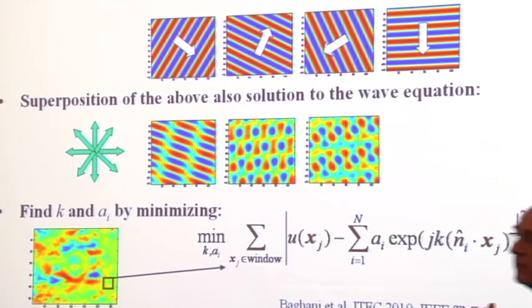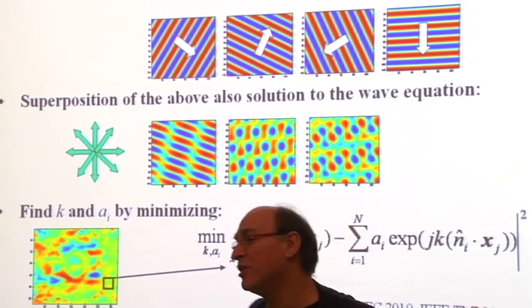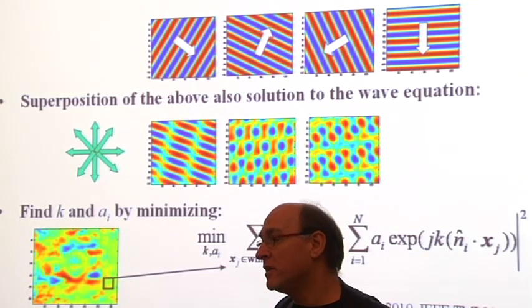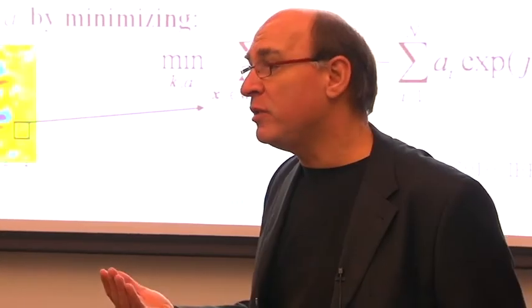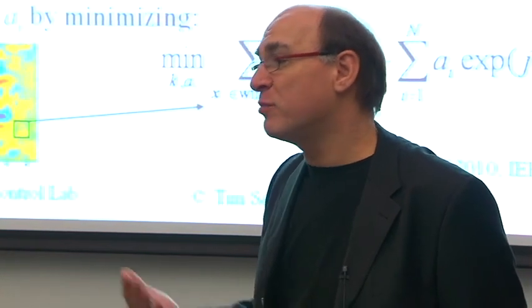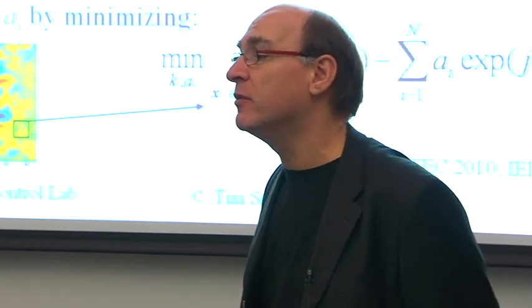In fact, the physics behind it is totally mind-blowing, to me at least, because what you have is using ultrasound to measure displacement. So how can that be? Ultrasound goes at 1540 m/s, so how can you use ultrasound to measure mechanical displacement? Well, it turns out that you have various ways of propagating waves into tissue, and these waves travel at vastly different speeds.